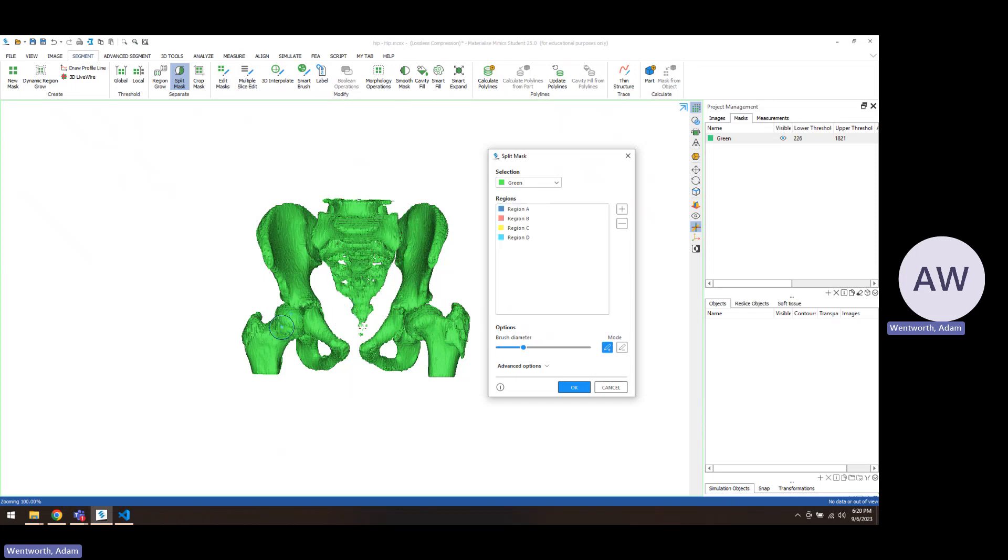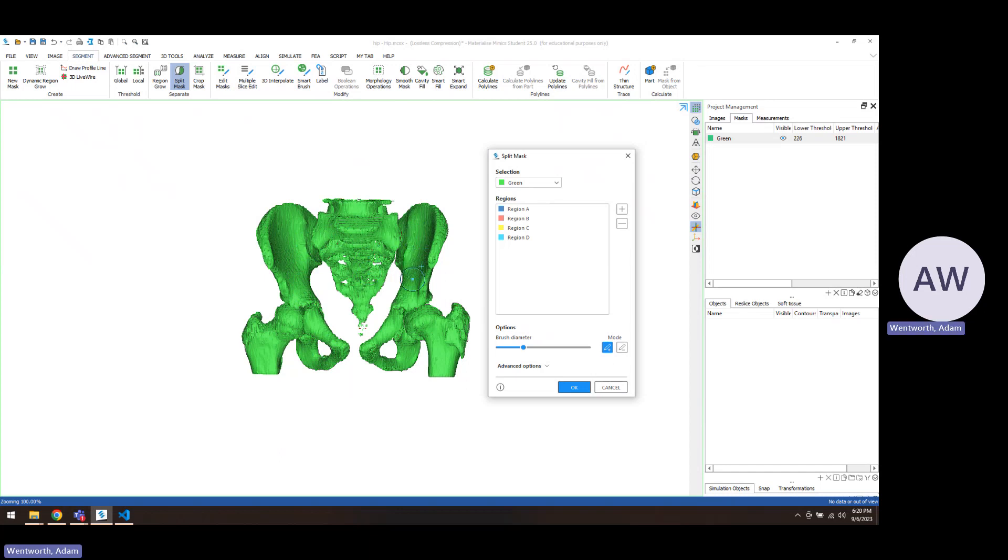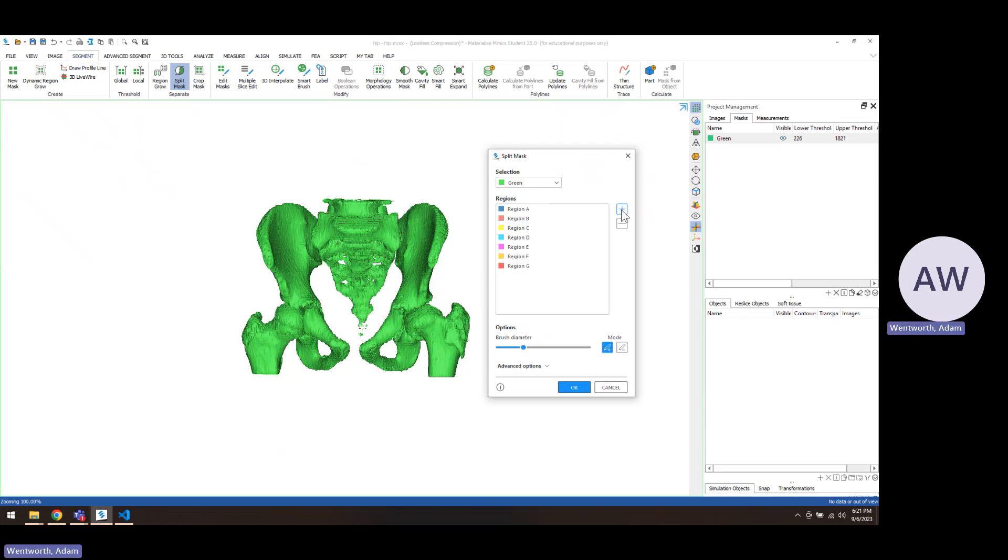Split mask is essentially painting onto the surface and letting us indicate where are the separate pieces. So if we count how many pieces we have, we have one femur, two is the ischium, three is the ileum, four is the sacrum, five is the other ileum, six is the other ischium, seven is this other femur. So we'll put seven parts in there, and we'll click the top one and we'll move left to right across.